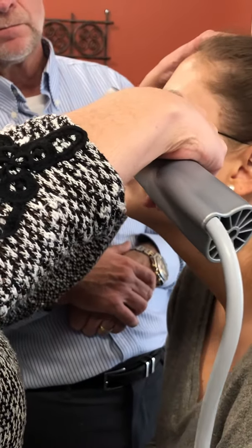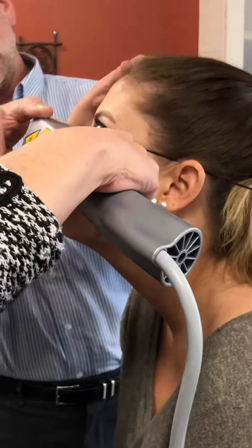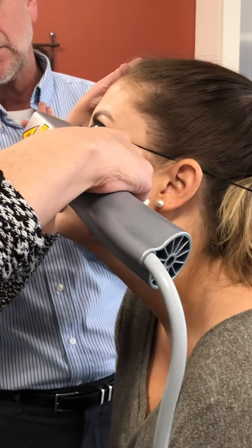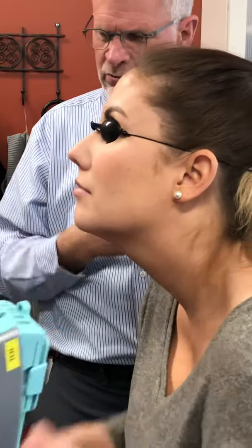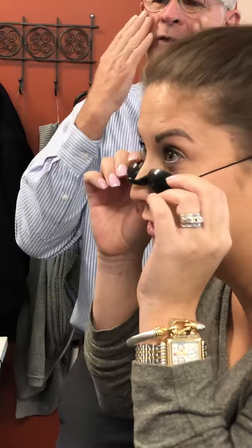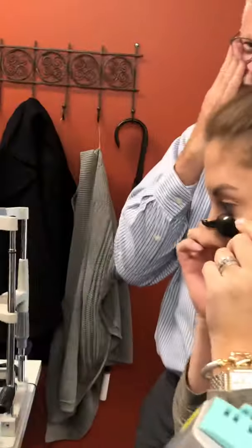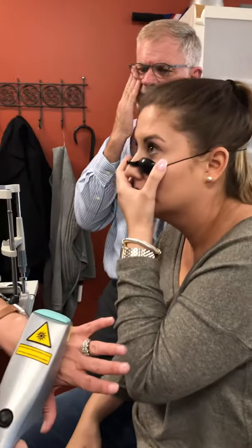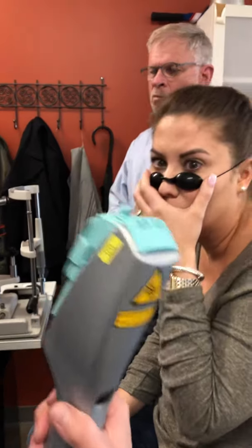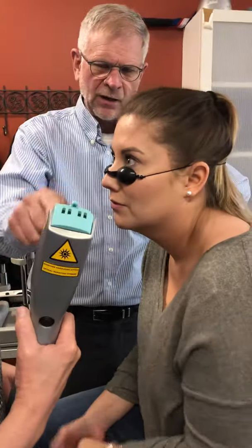You kind of want to get that light up into the lid. Now physiology, nose, cheeks, stuff's going to change on every patient. But first, you want to try to keep that IPL as flat or planar to the face as possible with the coverage. So getting as much of that crystal flat on the skin as possible. What's the crystal called? This whole square.